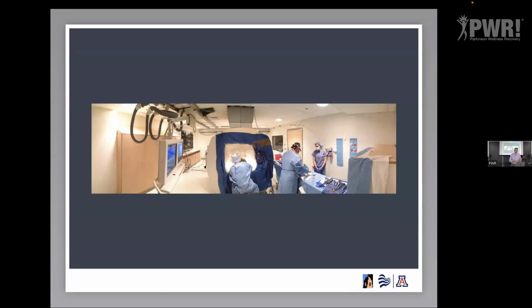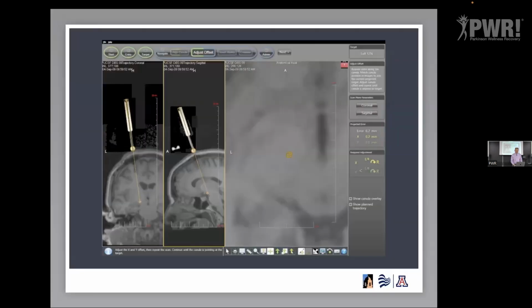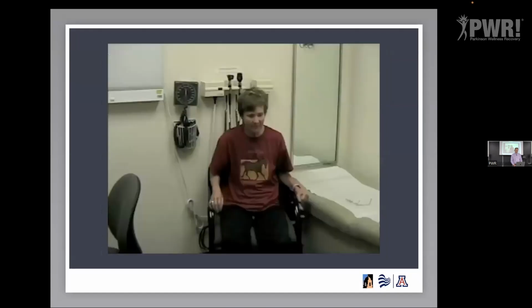So we have the ability to use MR images and this skull-mounted aiming device that mounts on the top of the head after you go to sleep. We can use this device to align the aiming device to the intended target. We can pass an electrode through there. We can take pictures as we're doing this to make sure the electrode is going right where we want it to go. It's a very accurate technique, and it eliminates the need for patients to be awake.